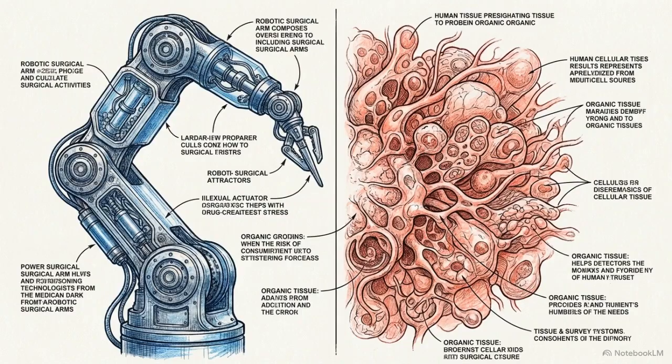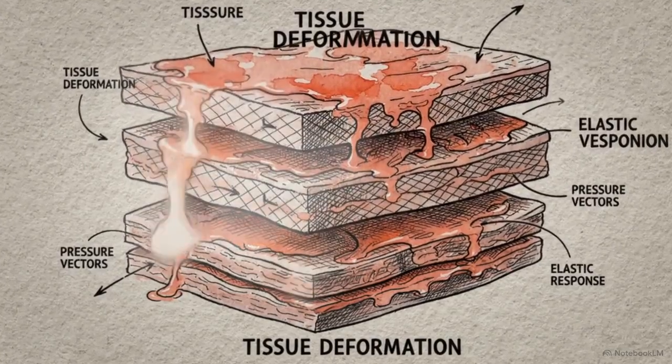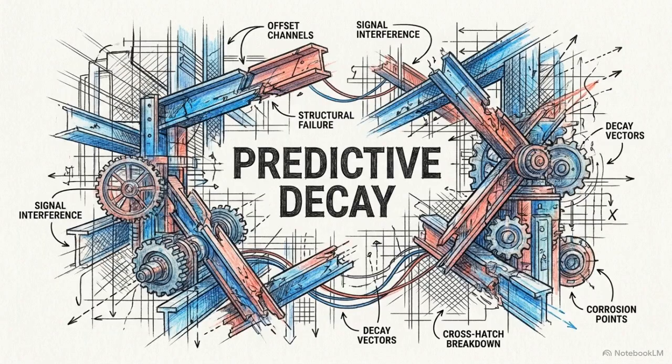Yet, while the hardware is rigid and precise, the surgical environment is entirely unstable. Patient anatomy, tissue deformation, bleeding, and changing lighting conditions are highly dynamic variables that refuse to stay constant. This clash between static algorithms and a fluid environment triggers the primary failure state for medical AI: model drift.